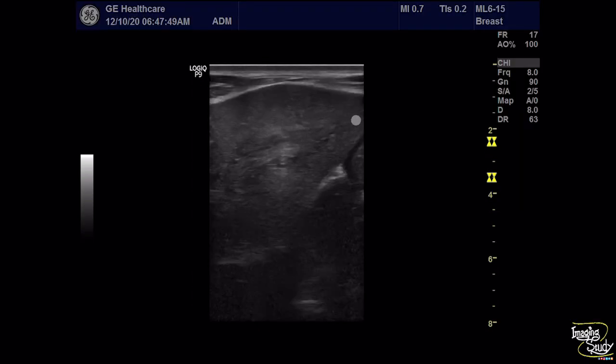If you want to end this case with biliary ascariasis only, the diagnosis will be incomplete. The question is how this worm came here — it was not born within the hepatic duct; it came from the intestine. So you cannot complete this examination without checking the intestine of this patient with a high-frequency linear transducer.